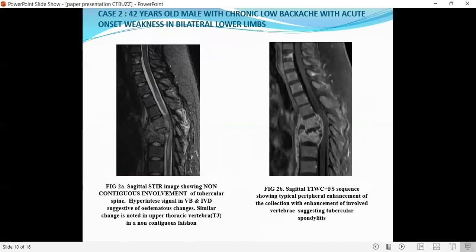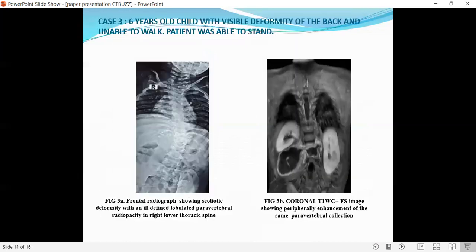Case 2: a 42-year-old male with chronic low backache and acute onset weakness in bilateral lower limbs. The first image shows non-contiguous involvement of the tubercular spine. The second image shows typical peripheral enhancement of the collection with enhancement of the involved vertebrae. Case 3: a 6-year-old child with visible deformity of back and unable to walk. The first image is a frontal radiograph showing kyphoscoliotic deformity. The second image is a coronal T1-weighted image showing peripheral enhancement of the paravertebral collection.